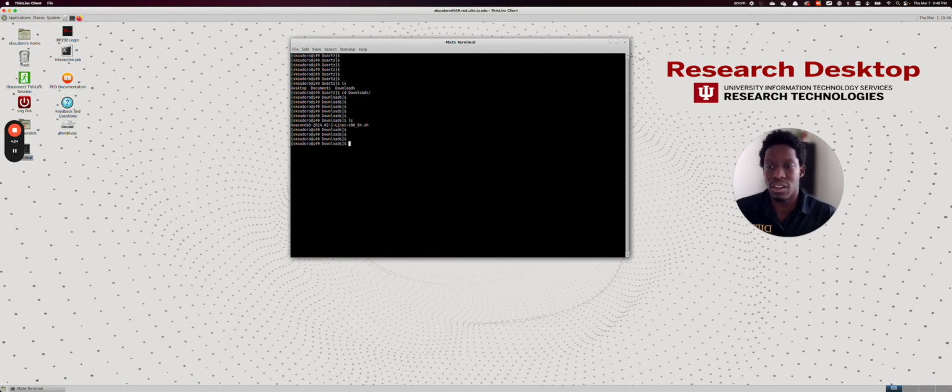So that's great. Now that Anaconda is present, we need to install it. To install it, we do the classic way to run a SH script. So I will just type ./Anaconda3-2024.02-1-Linux-x86_64.sh.